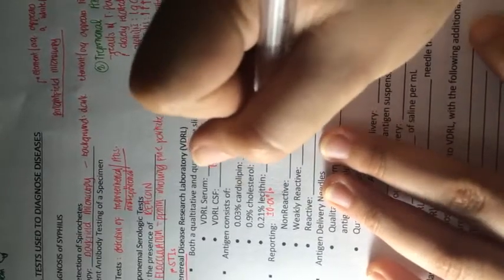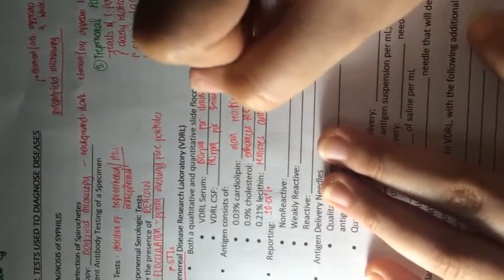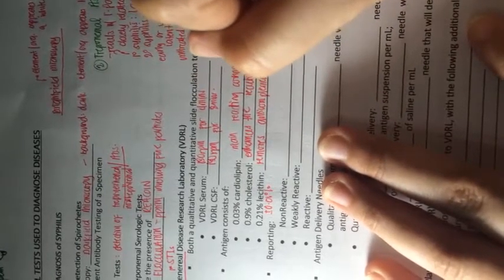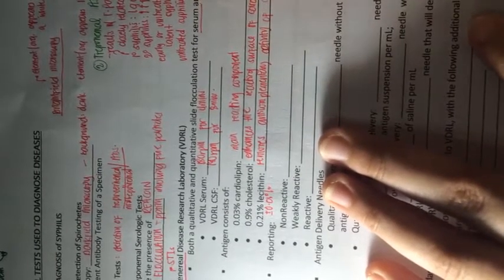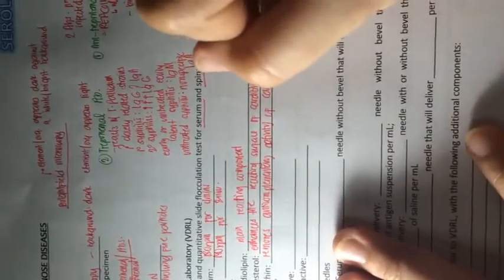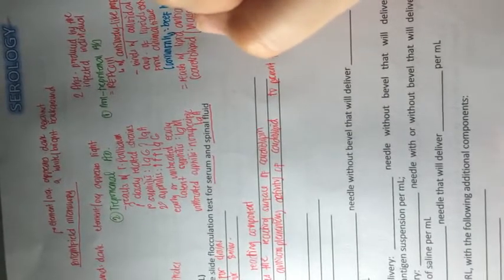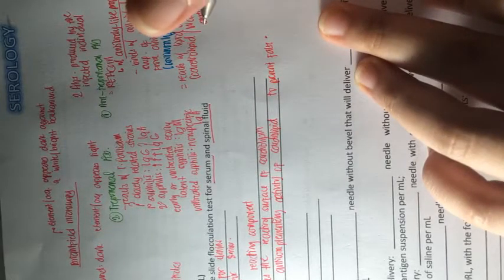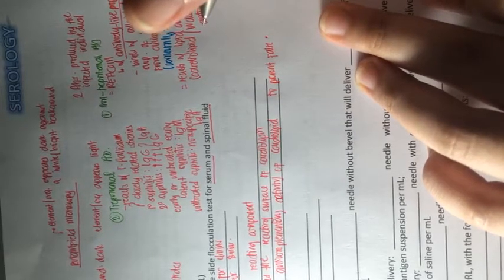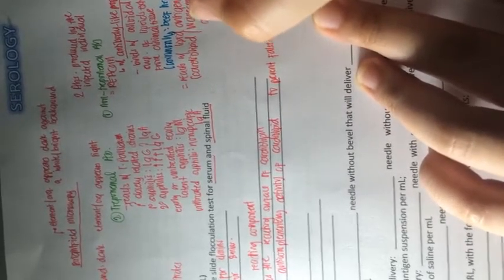The purpose of the lecithin is to remove the anti-complementary activity of cardiolipin, to prevent false positive results.